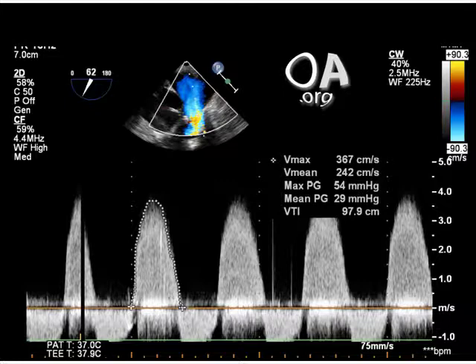Here, our patient has a peak gradient of 54 millimeters of mercury across her pulmonary valve. Remember, when our patient had her preoperative TTE, she had a peak gradient of 80 millimeters of mercury across her pulmonary valve. Often these peak gradients are reduced under general anesthesia with controlled ventilation and 100% inspired oxygen.